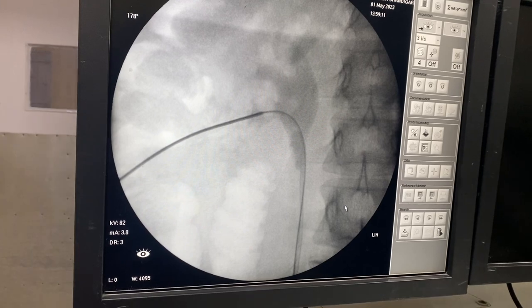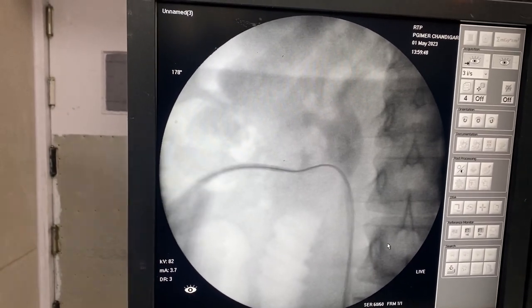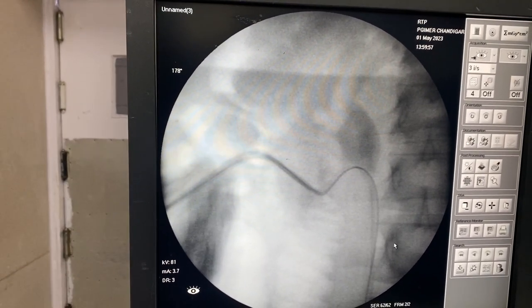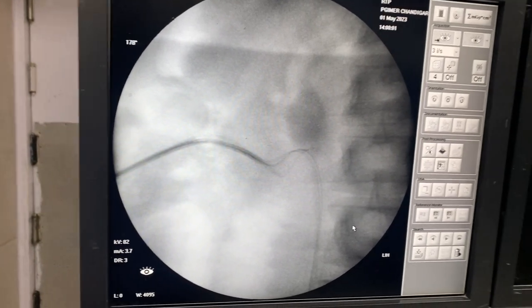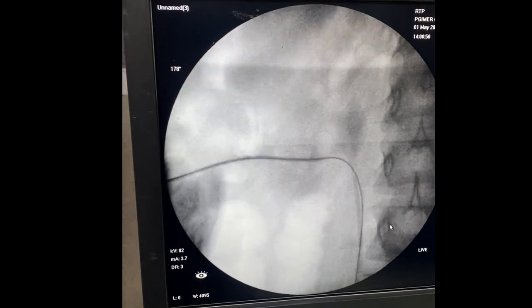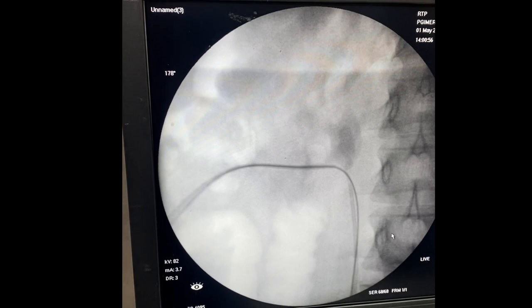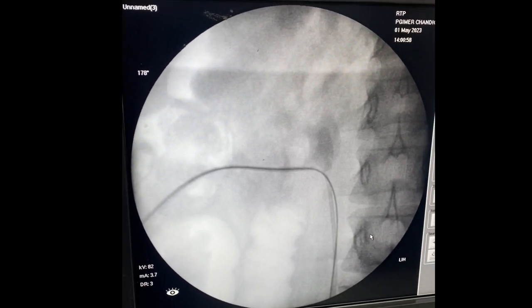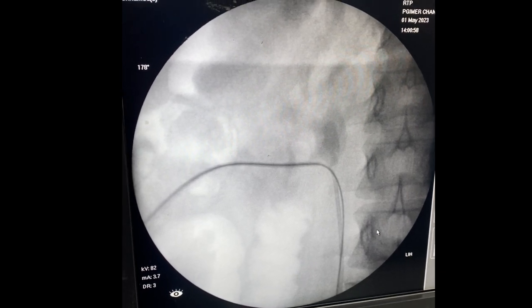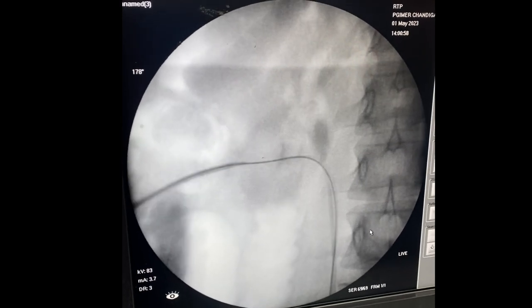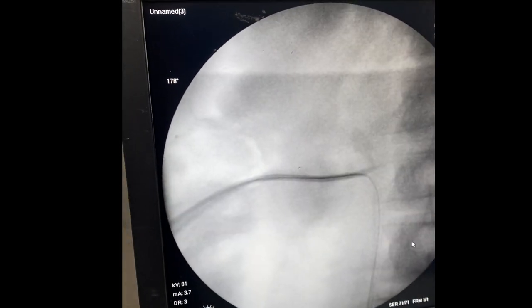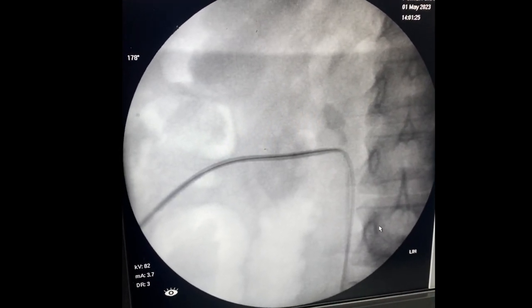The next step is serial dilatation. I first passed an 8 French dilator, but on the surface of the kidney there was some buckling. When this happens, it is not advisable to push further. The tip to overcome this is to use a stiffer guide wire or a smaller dilator, then gradually increase the size. I changed to a 6 French dilator — this time it went into the kidney. Sometimes in a hurry people try a bigger dilator, which leads to difficulty. After this I exchanged it for an 8 French dilator, which entered the kidney with rotatory movement.